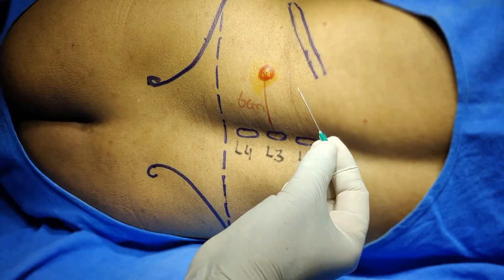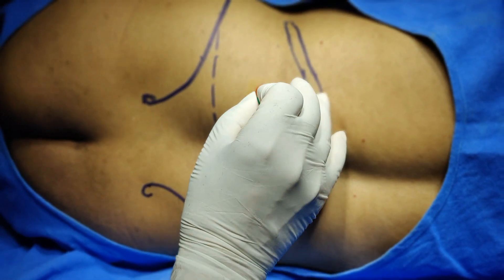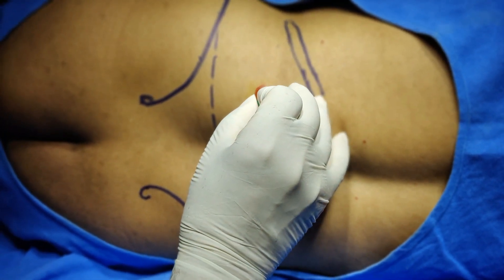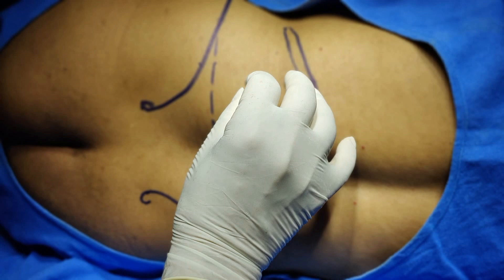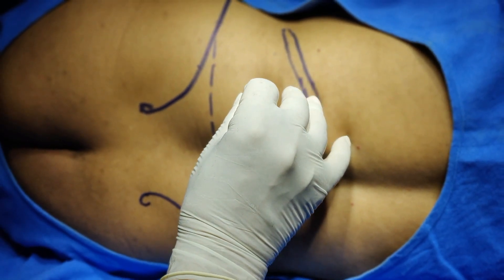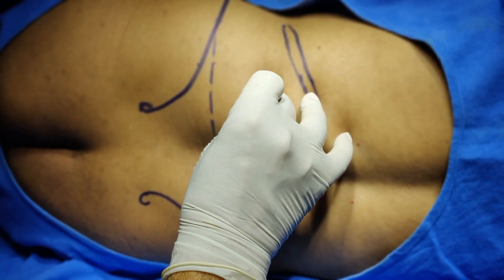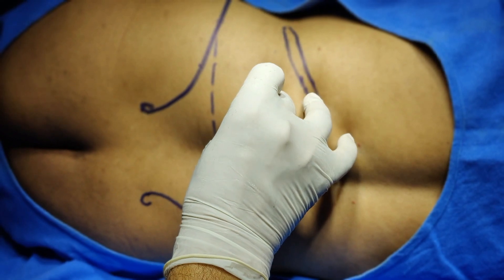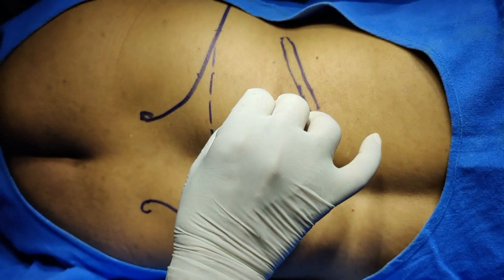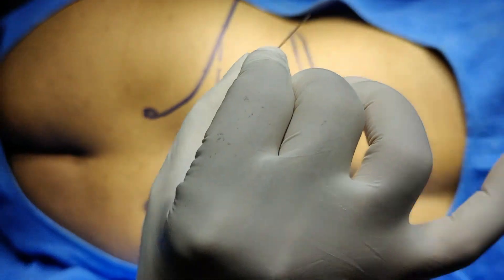Now use a 21-gauge needle just to make a skin puncture at this entry point, because the skin of the back is quite thick and presents a lot of resistance. Just make a puncture here and then remove the needle.